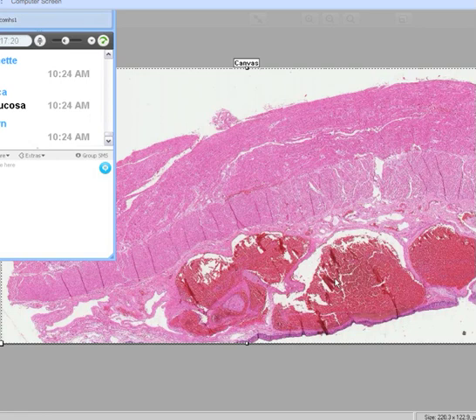So at this point, does somebody want to guess the diagnosis or should I terrorize you into it some more? What would you call massively dilated, thin-walled blood vessels or veins in the submucosa of the esophagus to the point where it looks like it might even rupture the squamous mucosa and the patient's going to bleed to death? Of course it's varices.